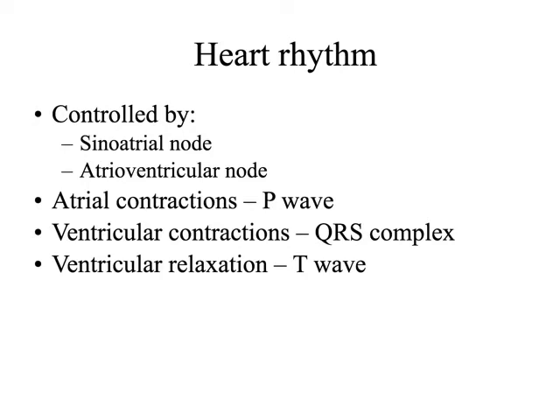So we saw some CTAs recently of the heart where they were doing gating, and they're looking for the P wave. Are they? I could be wrong about that. Because they said, well, we were watching, the P wave might be what's turning it off. Like they might be telling the machine, stop it when you see the P wave, reinitiate when you see that QRS. Does that make sense? Each scanner, that's a really good point, and I'm going to have to defer that to the maker of that scanner.